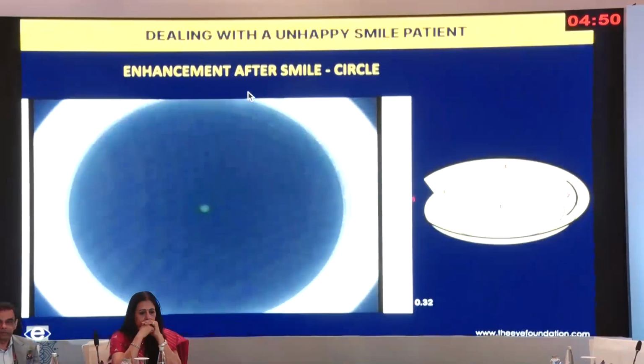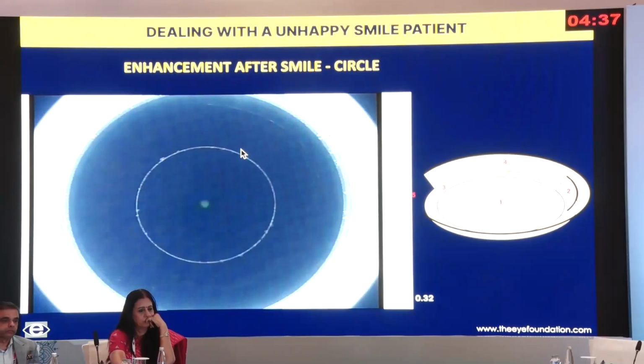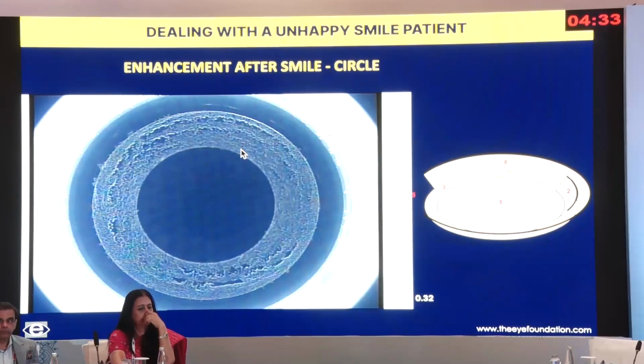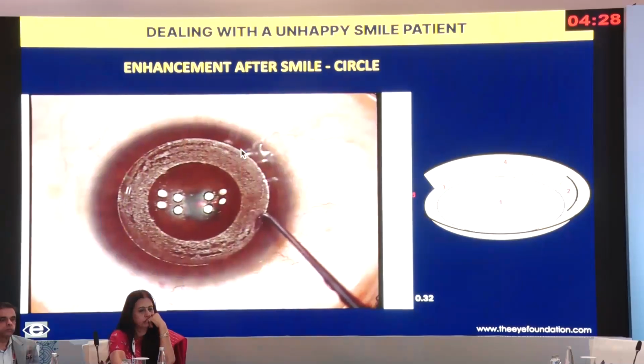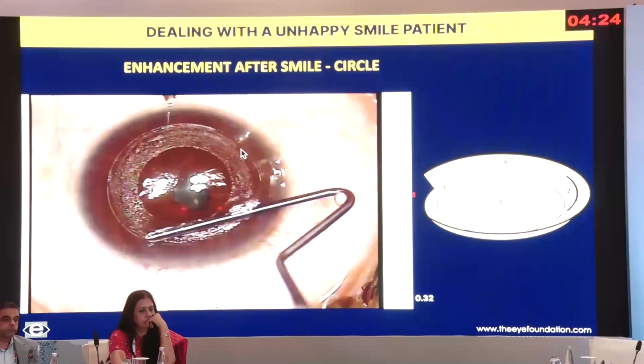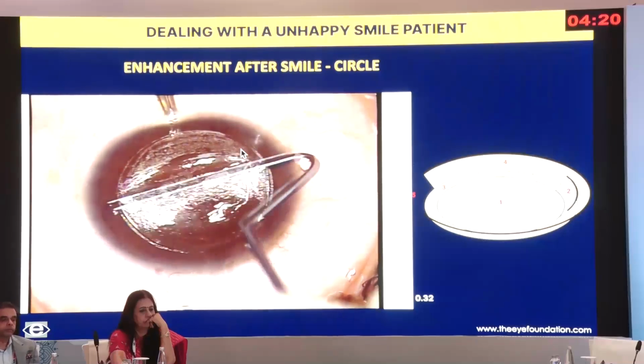Now, of course, the CIRCLE software has become available. Obviously, when we used to do PRK, for a day's time the patient used to complain of irritation, discomfort, watering, prolonged usage of steroids, etc. Here, we are able to convert the cap of the SMILE into a flap and lift it up. Basically, there are certain parameters that you feed in, and then you can see the cap being converted into a flap, and we can lift up the flap.